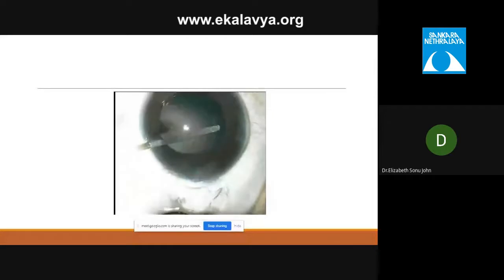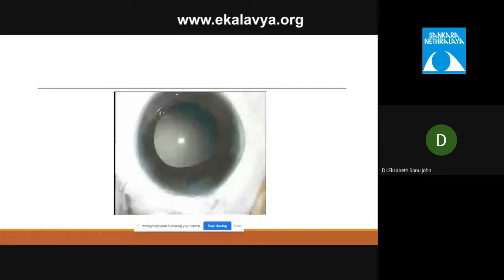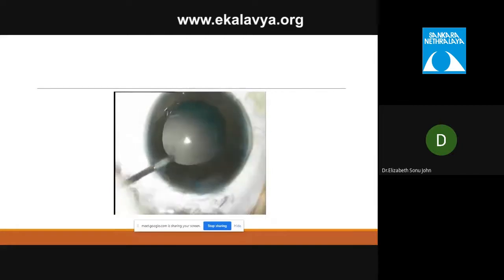So there is vitreous in the AC that you visualize. Once you have done the section of the vitreous, then you go through the side port, suture the wound, and through the side port, swipe any strand of vitreous to the center of the eye.